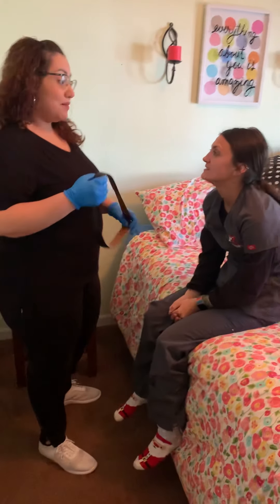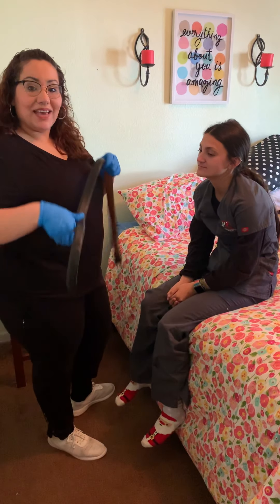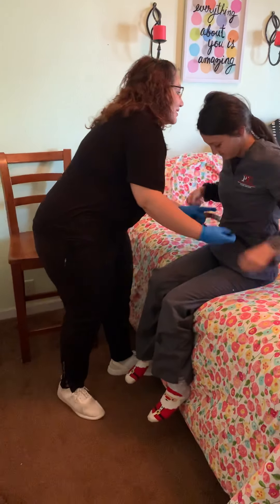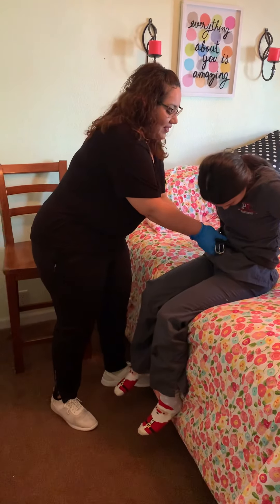She can assist me. Can you assist me? So we're going to go ahead and, with her help, bring her to the side of the bed. One, two, three — come on up. I'm going to make sure that her body is aligned correctly. Do you feel dizzy? Are you okay? She's perfect.